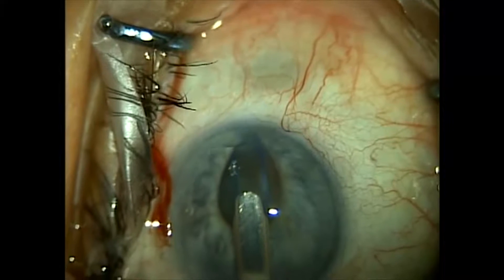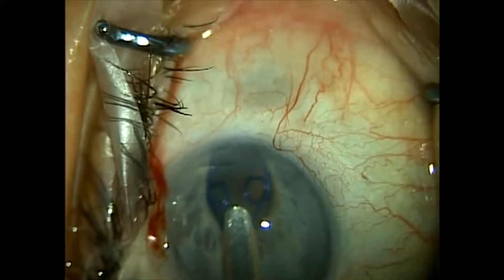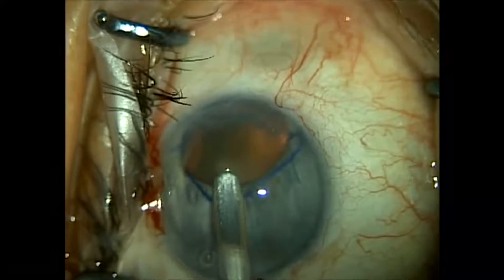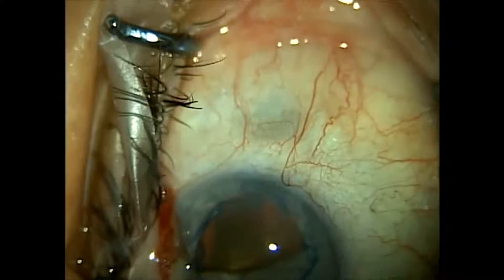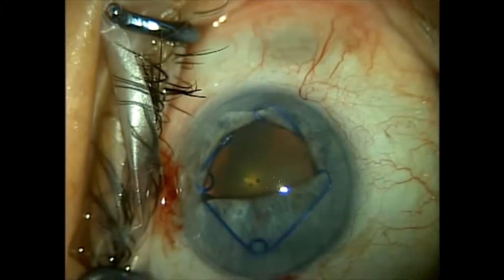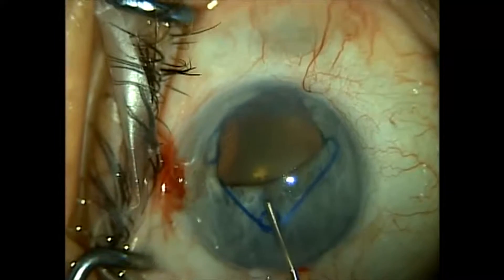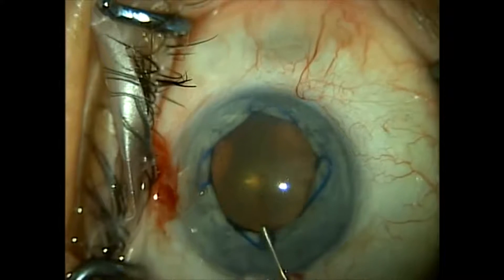We engage the most distal portion of the pupil, then try to get the left ring to grab the pupillary border and the right ring to do the same. I attempt to get the trailing ring to engage the pupillary border but it's too difficult, so I remove the inserter and use the second instrument — in this case a chopper — to grasp the last scroll and gently place it so it engages the proximal pupil.